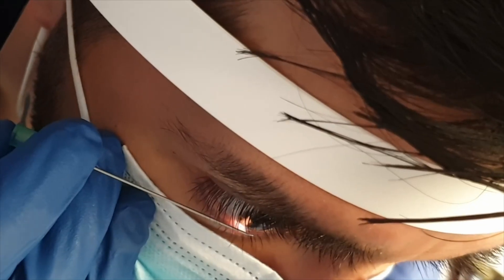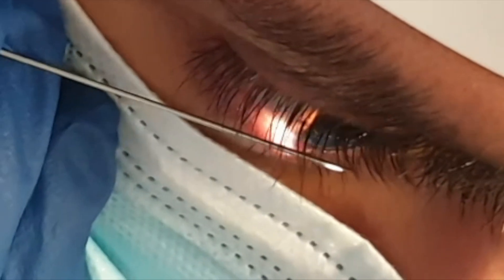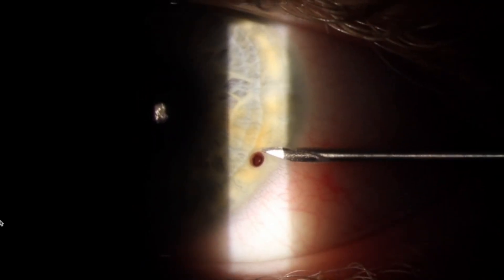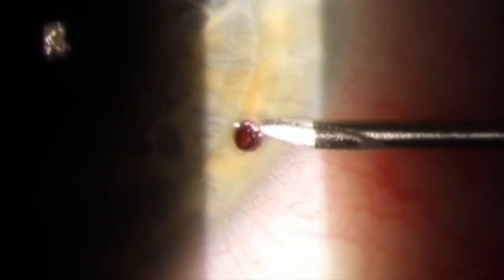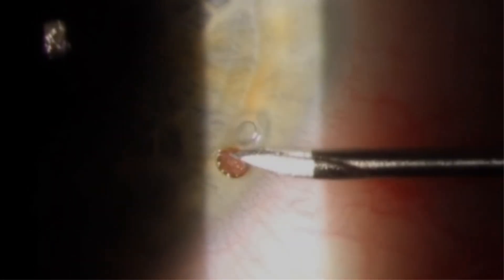When using a needle, approach the patient from the side and slightly behind the eye, keeping parallel to the surface of the cornea. Do not approach with a needle pointing towards the cornea. Get the needle in position with your naked eye — not looking down the eyepieces of the slit lamp or with your head torch. Once close, look down the eyepieces for a magnified view and slowly and cautiously move closer to carefully dislodge the foreign body and any rust ring if possible.